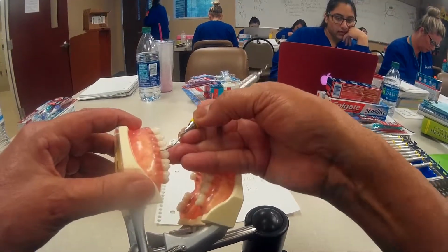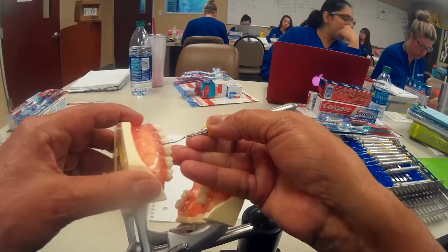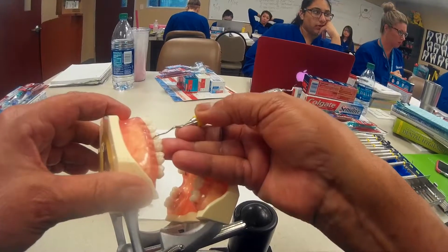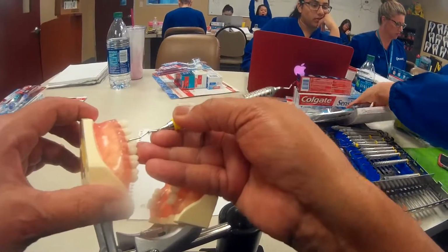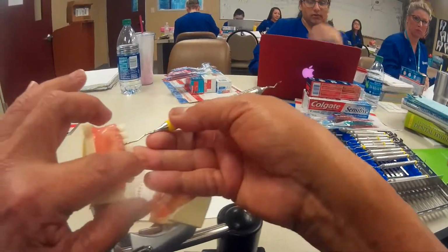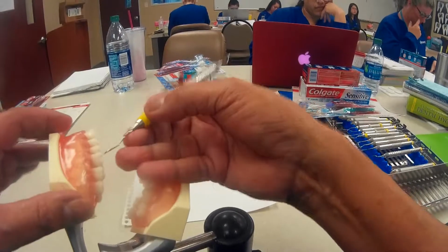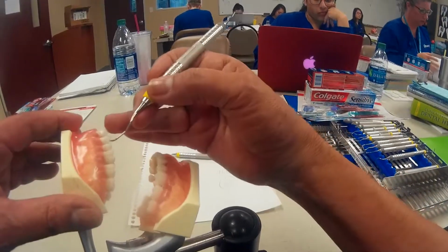And watch how my hand pivots to get that adapted correctly so that that terminal shank is standing straight up and down on the mesial surface of that tooth. And yes, I am fulcrumed on the same tooth, which I'm not supposed to be doing, but like I said right before that, I probably would be using an extra oral fulcrum.